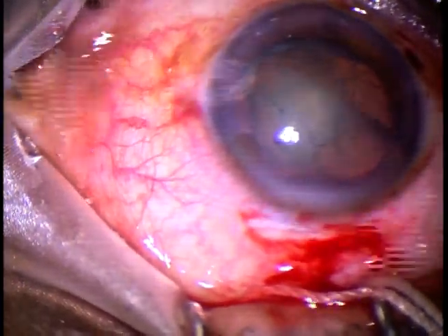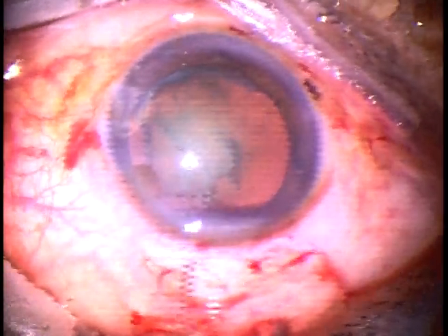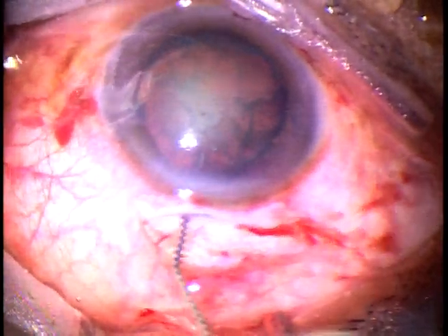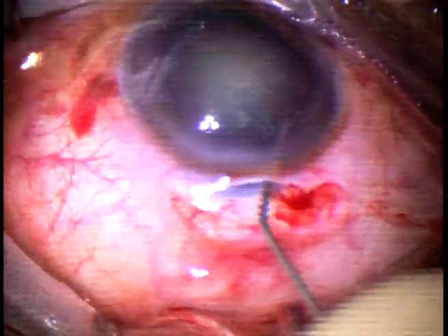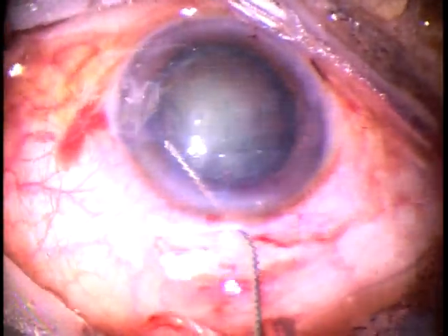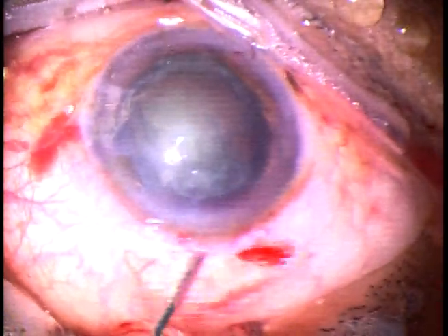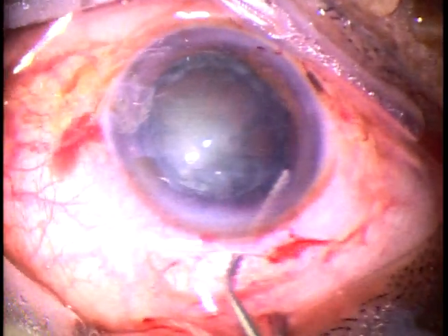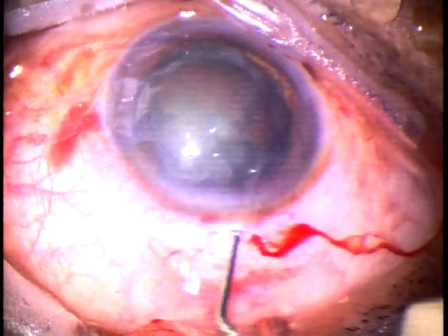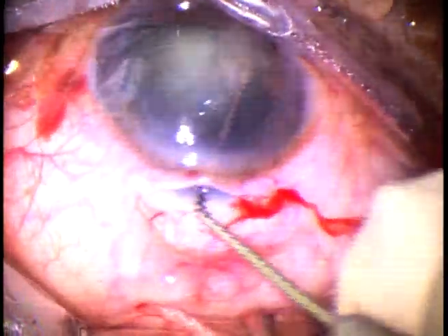The tunnel has been opened. Hydrodissection is done — fluid wave is passed from the right side, and the equator has prolapsed out of the capsular bag. When the equator prolapses out of the capsular bag, it is easy to prolapse the nucleus into the anterior chamber. Viscoelastic is injected into the anterior chamber.